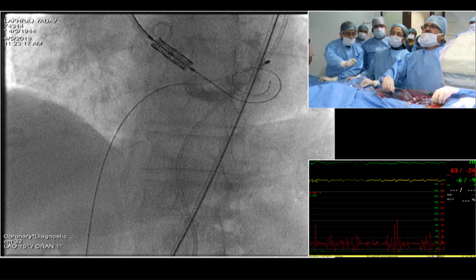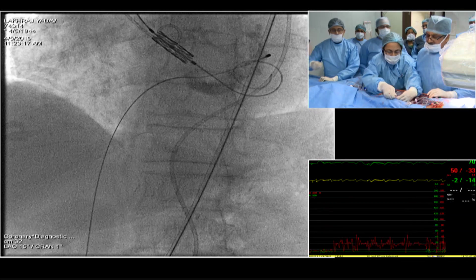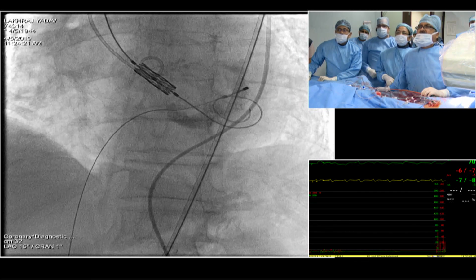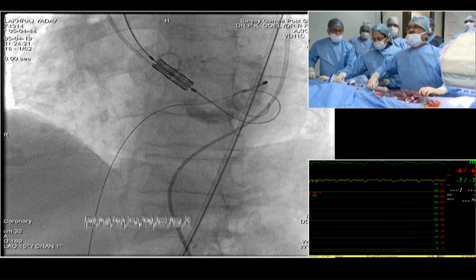Shoot angio test, please. Angio test, please. Give a bolus of adrenaline. Come on, inject. Yeah, that's fine. AR is the problem. That's fine. Severe AR.